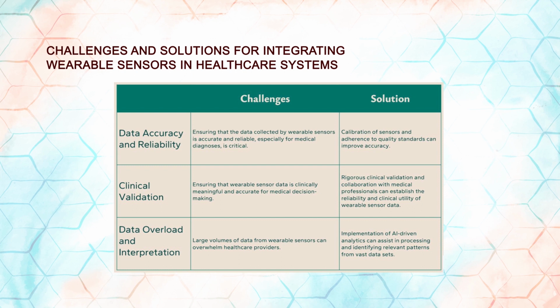The next one would be data overload and interpretation. Its challenge is that large volumes of data from wearable sensors can overwhelm healthcare providers. Its solution is that the implementation of AI-driven analytics can assist in processing and identifying relevant patterns from vast data sets.